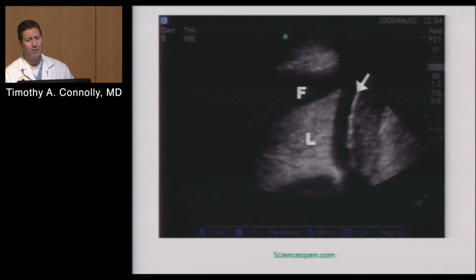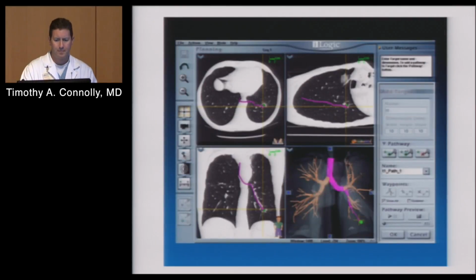This is a vision of an ultrasound. And bottom line, when we're doing thoracentesis, this is the image we have to save, where we show fluid, lung, diaphragm. The needle's coming in from right there. So that's into the black space where we can drain that fluid. This is not a large effusion.